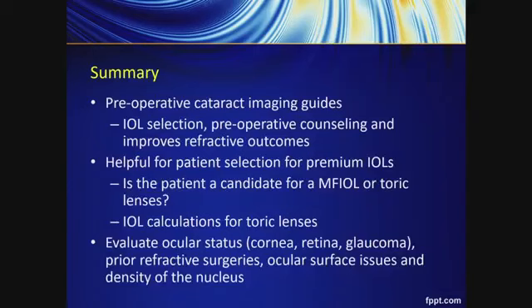So in summary, I think that pre-op imaging is a very vast field. It's increasing every year. And I think it's always important to think just beyond the non-contact biometry to look for the IOL power. Think about all the different parts of the eye that you should investigate to make sure you have an excellent outcome.